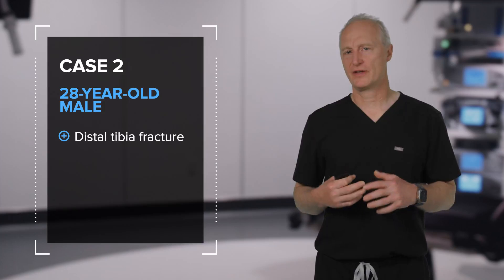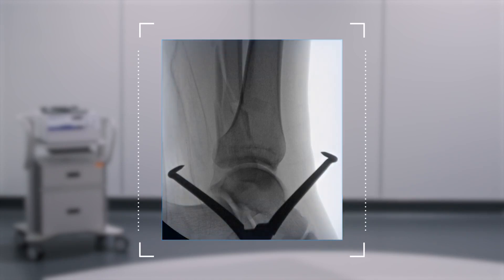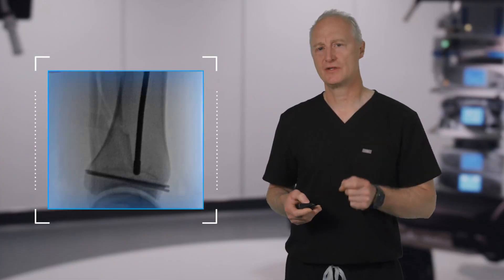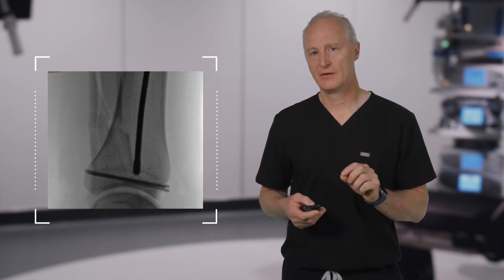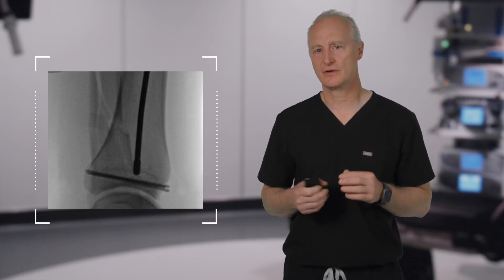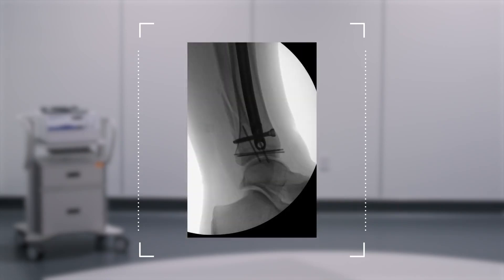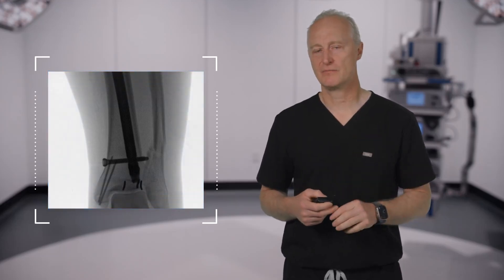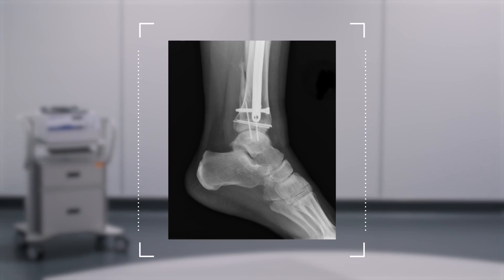Case two: a distal tibia fracture, distal third, with associated intraarticular injury. You can see the posterior malleolus and the fibular fracture, an attempt to obtain a reduction with a percutaneously placed clamp, and then neutralization of that posterior malleolus fracture and compression with the fully threaded compression pins. When placing these pins percutaneously, you want to follow the notch in the pin until it gets to the articular surface or close to the subchondral surface and then snap it off. I like to leave the pins a little proud in case I ever have to come back and take them out. Fully threaded compression pin fixation achieves anatomic restoration of the talus under the distal tibia and maintenance of that reduction through the healing process.